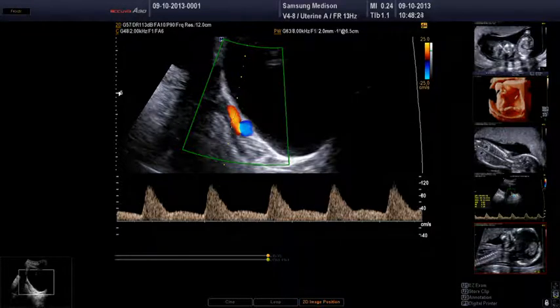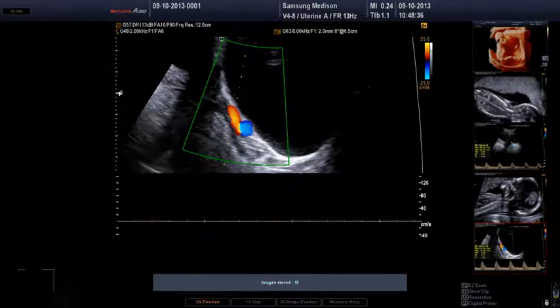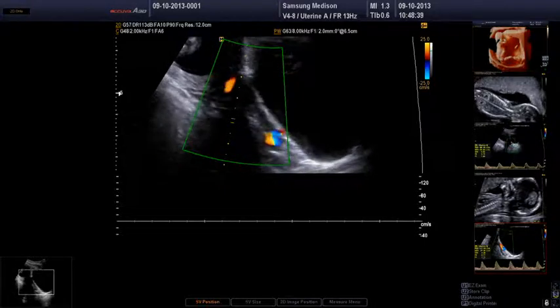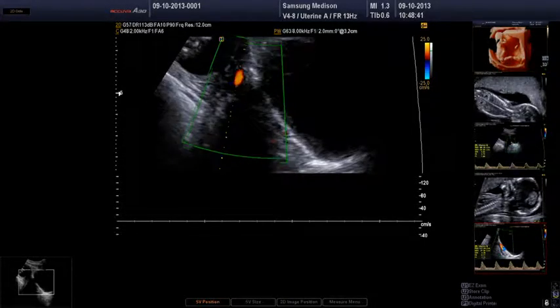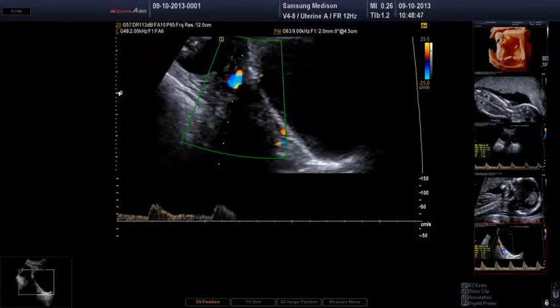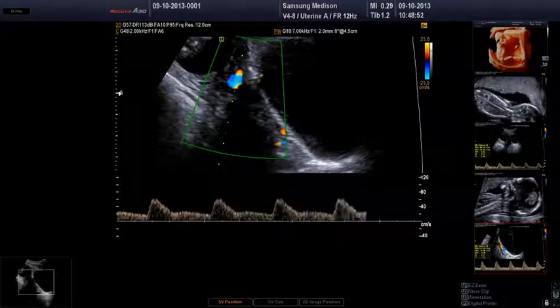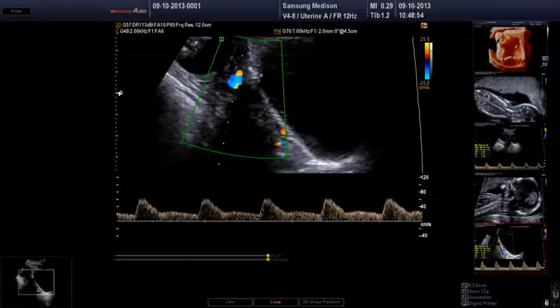But you can see here that we've got a fairly nice waveform. And what I was going to do was just demonstrate a bit higher. So the PI here is 1.7 and our PSV is 117. If I try and take that vessel higher up, let's say here at the base of the lower segment, that's about 3 centimetres difference. So you can see now the character of that vessel's very different. If we just put the measurements on.